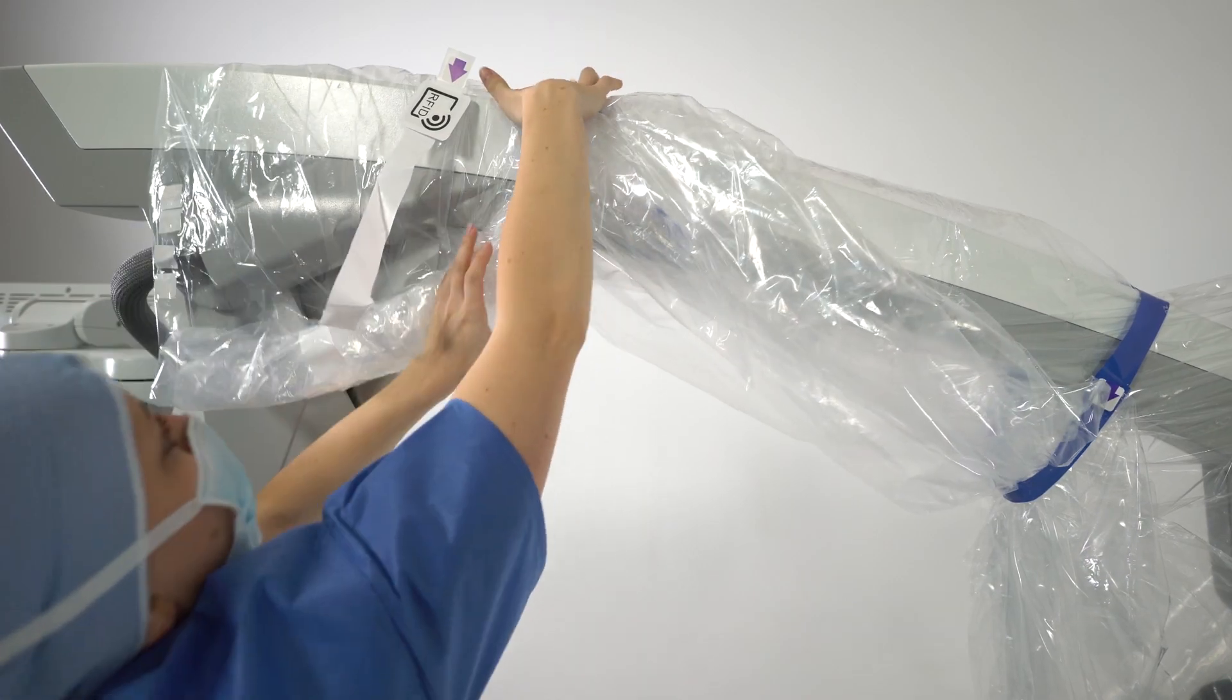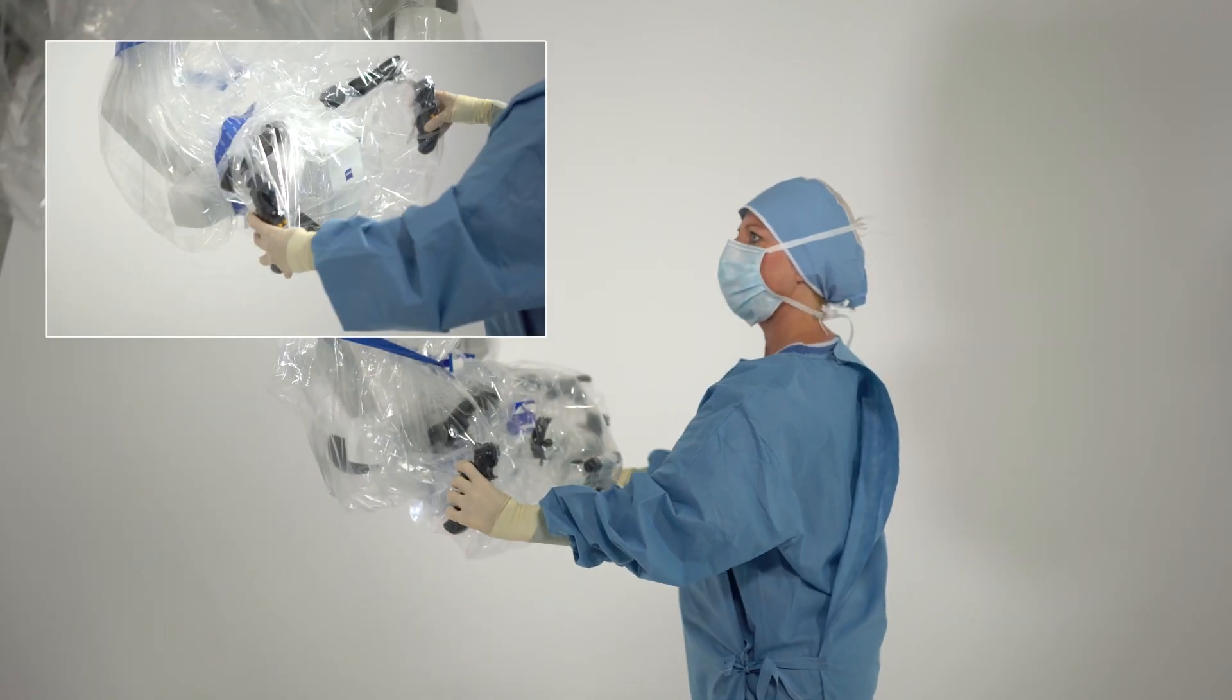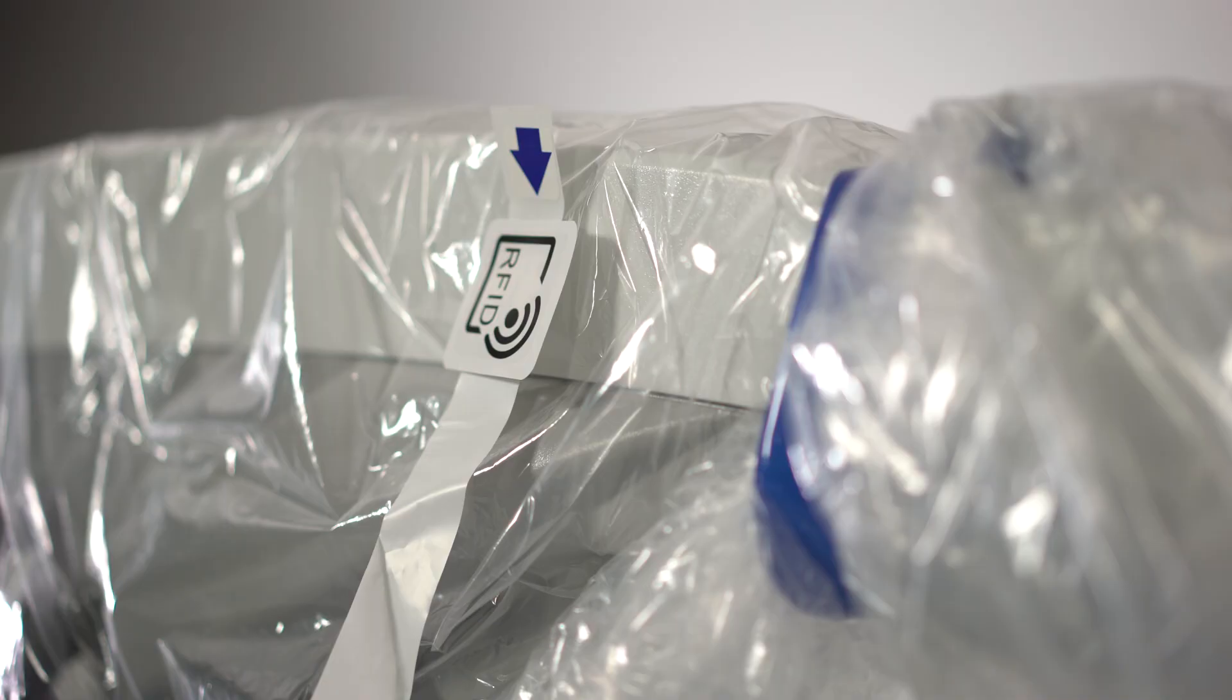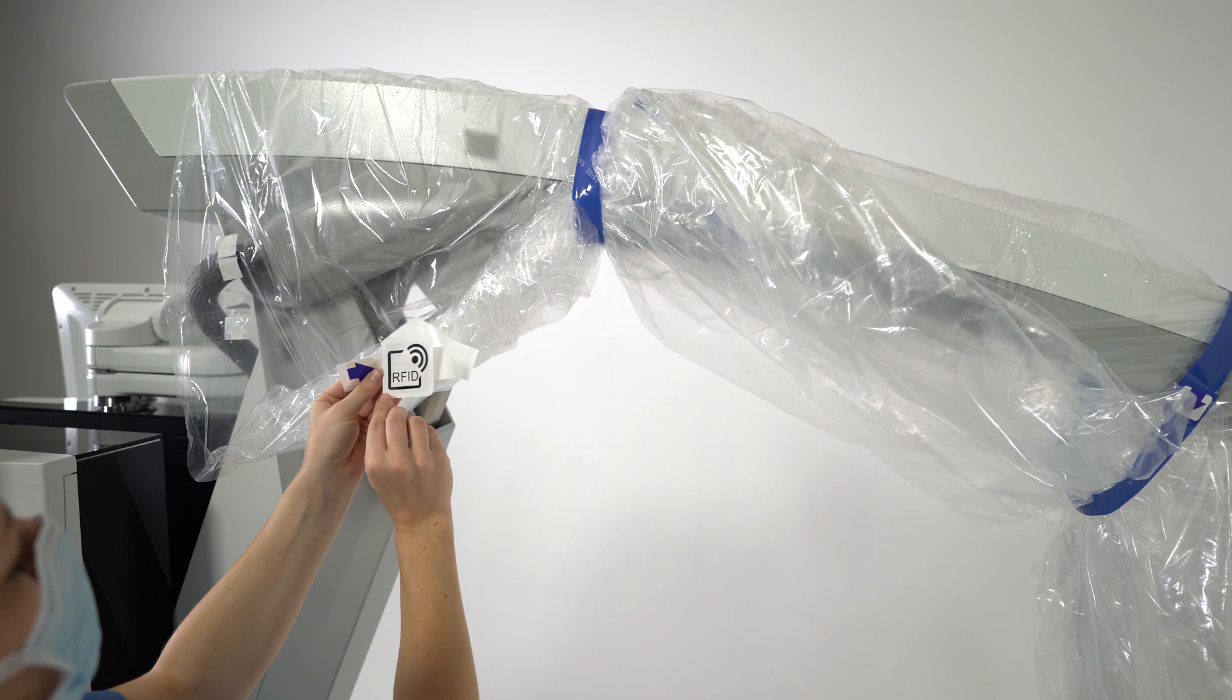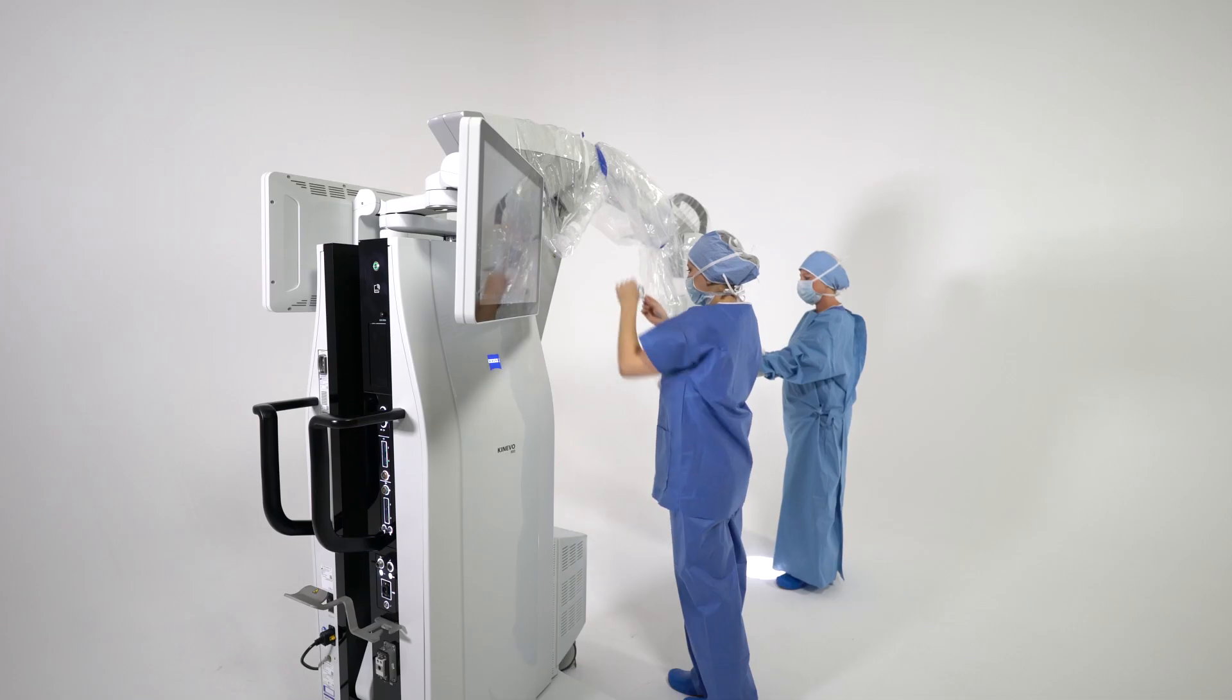After draping, check free movement of Zeiss Kenevo 900 in all three axes. Take the RFID sticker off the white band and place the RFID sticker at the back of the device, indicated with an RFID sign.